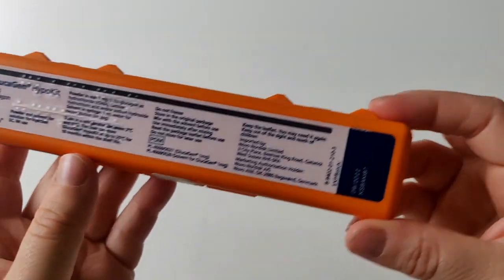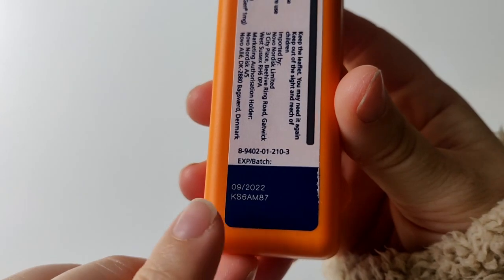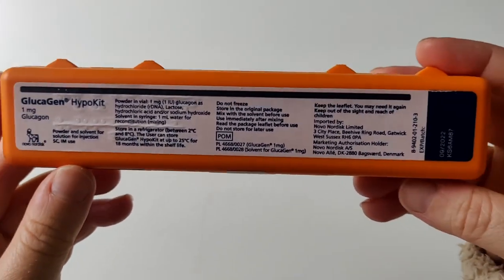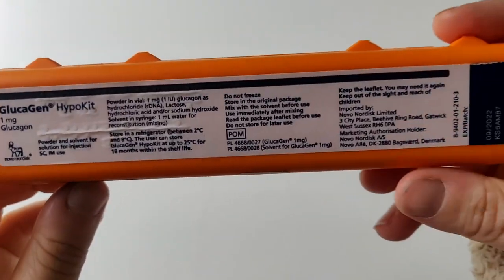Before we open it up, the reason I'm showing you this today is because mine is actually expired and I have some new ones on the way, so you should always check the date on there to make sure that it is in date. As you can see, this is very out of date, so I have my new ones coming soon.